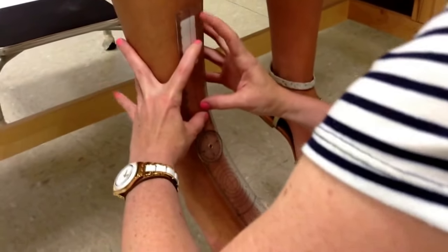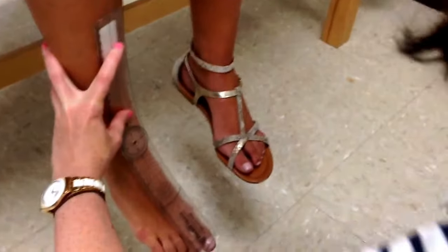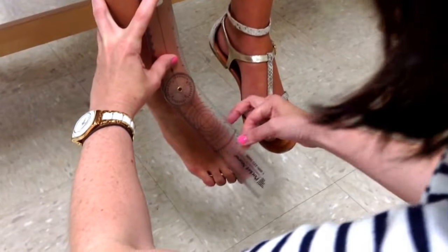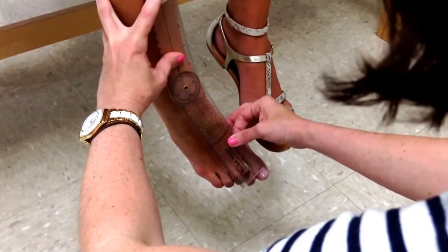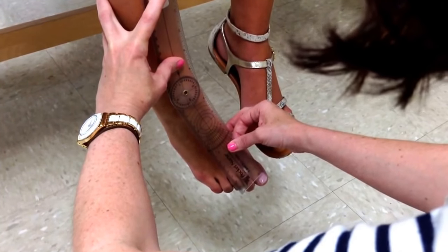I line it up with the tibial crest, and again I like to hold it with two fingers so it doesn't go anywhere. I'm instructing the patient: I want you to bring your foot or your toes in toward the other foot. My moving arm lines up with the midline of the second metatarsal. She's got about 17 to 18 degrees of inversion.